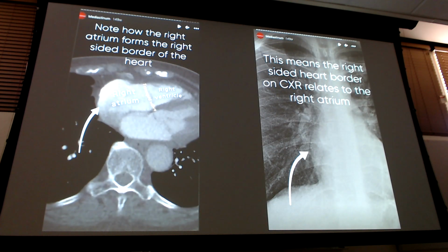Here is that CT I was telling you about. So now look here. I got my spine, I got my right atrium, and how it bulges out on this side of the spine, right, which is why I can see it. And even the part of my right ventricle is on this side. Look, it's lined right up with left ventricle stuff too. Like, it's too hard to make out, which is why we can't see that right ventricle on a PA x-ray.